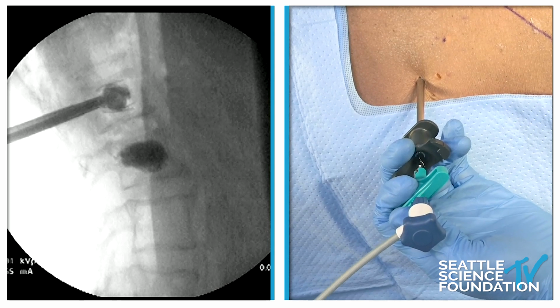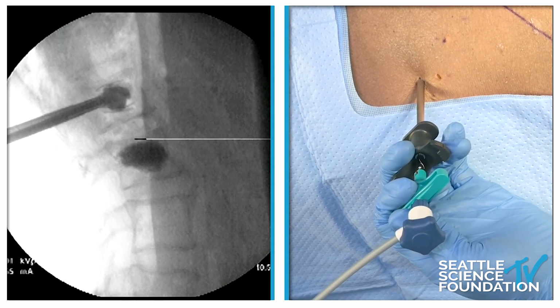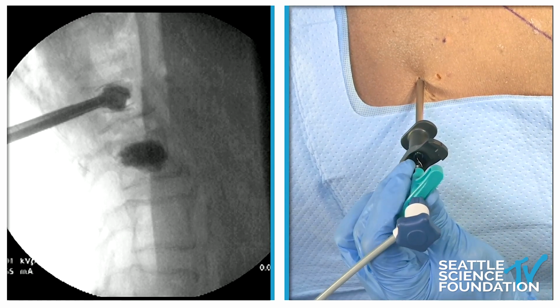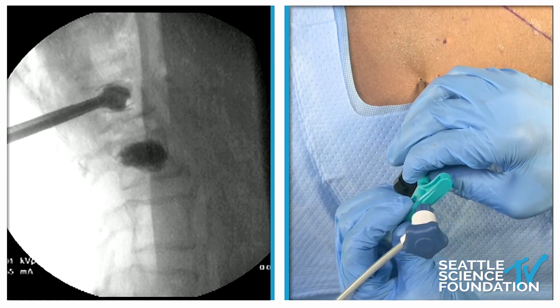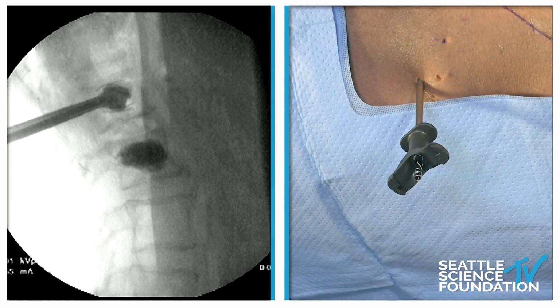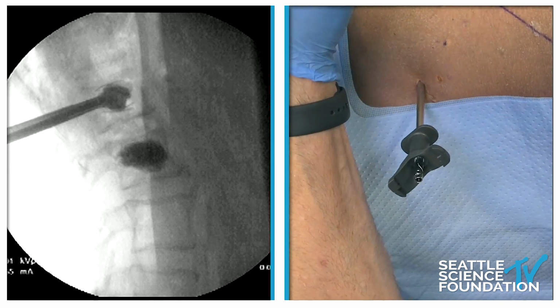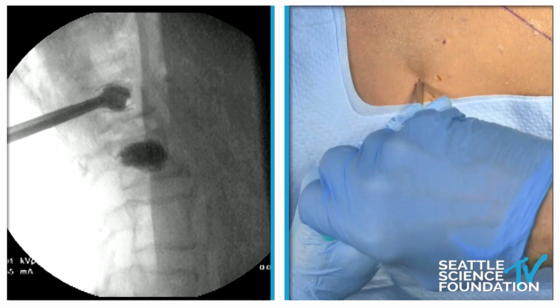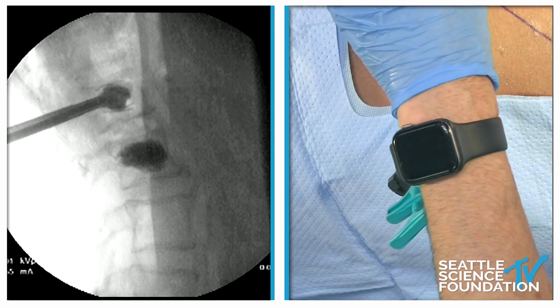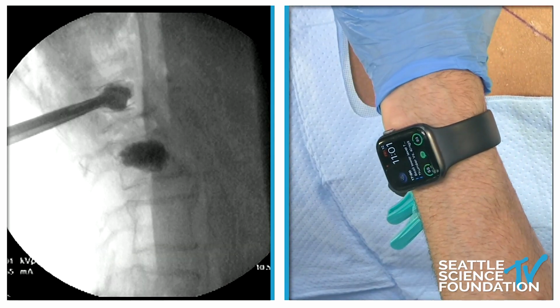Okay, it fills the area where the spine jack will hold up there. And we'll come to the other side, and we'll kind of swap these out. It fills the area of excursion where the spine jack lifted, first of all. And then it will start to fill around the anterior portion of the vertebral body in kind of a horseshoe shape. It's the natural tendency of the cement flow. So we'll get a little bit more cement on the other side.